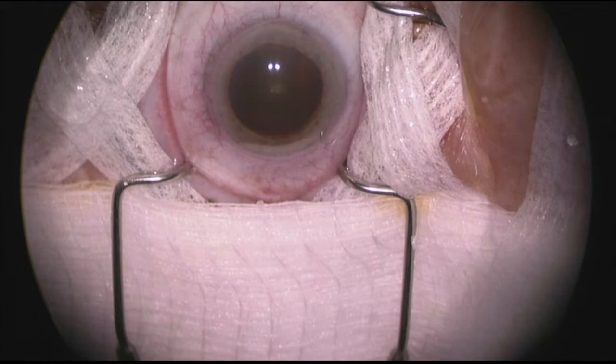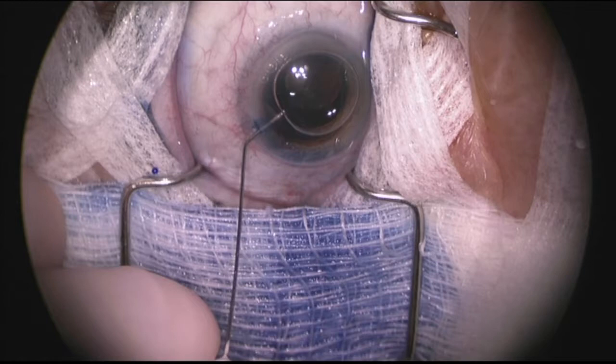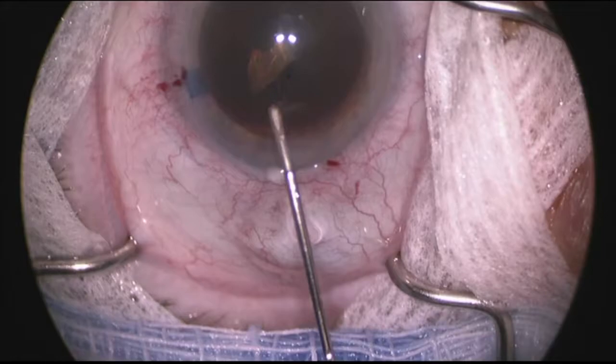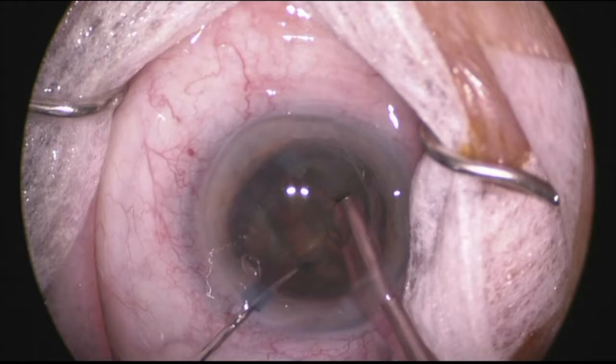First, epinephrine is injected into the anterior chamber, followed by air, trypan blue, and balanced saline solution. Next, the anterior chamber is filled with viscoelastic, and a continuous capsulorhexis is performed. The nuclear material is then phacoemulsified and removed using a combination of divide and conquer and phaco-chop techniques.